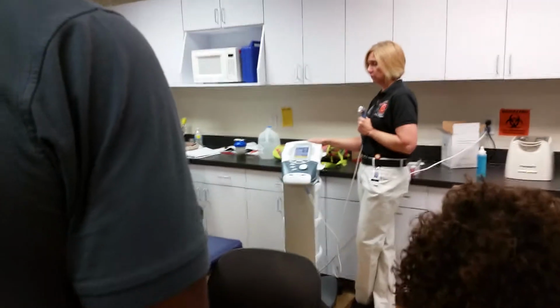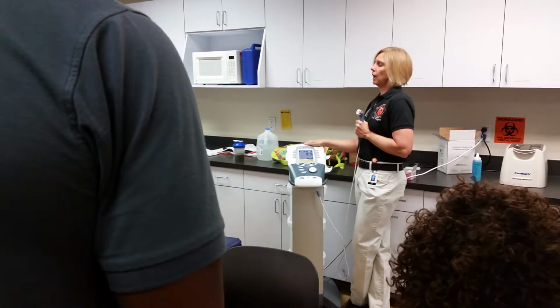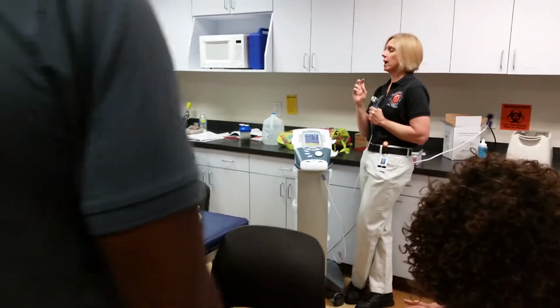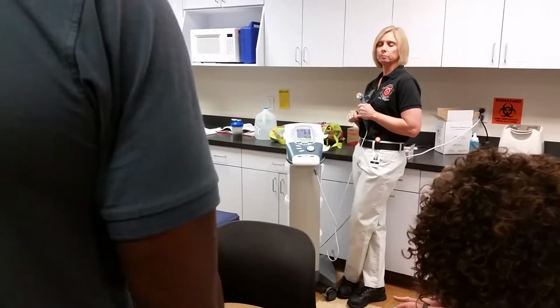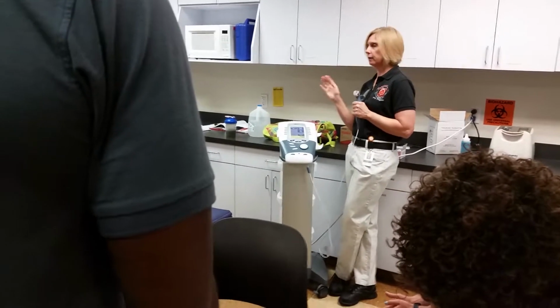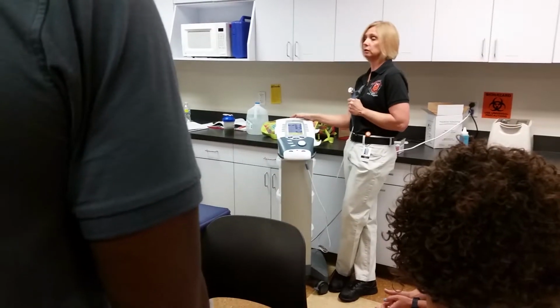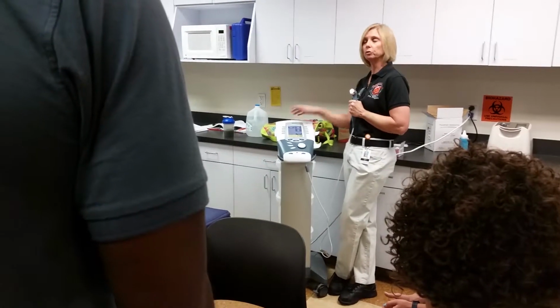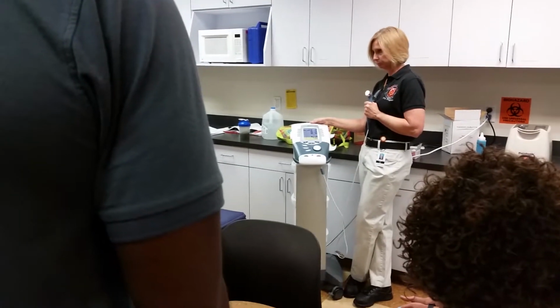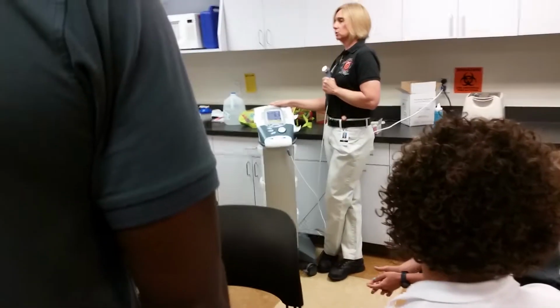And turn it down. If you're doing a pulsed application, remember the 20% pulsed is what most of the research is done on, and that is for non-thermal effects. You don't need to go above 0.5 to 0.8. Once you get there, they're not going to feel anything, you can stop. Don't keep trying to increase it and ask them if they feel it. They won't. Okay? So you don't need to go beyond 0.5 to 0.8. Perfectly.